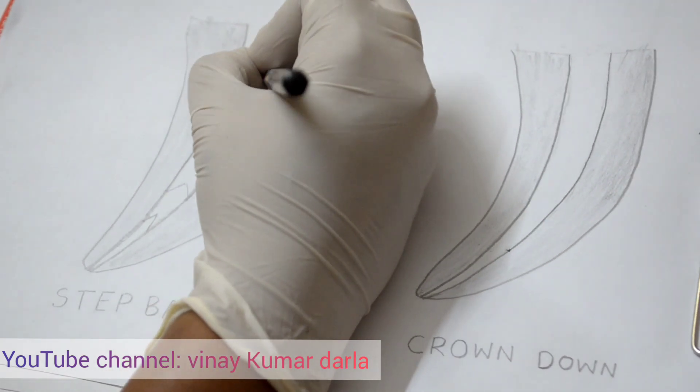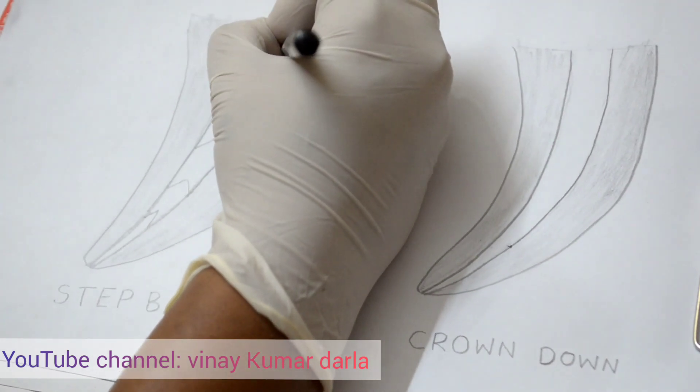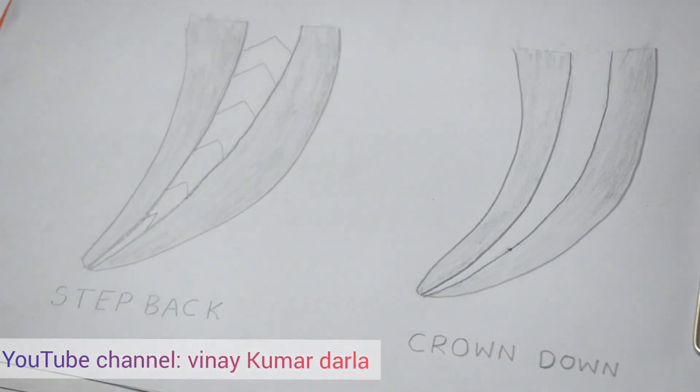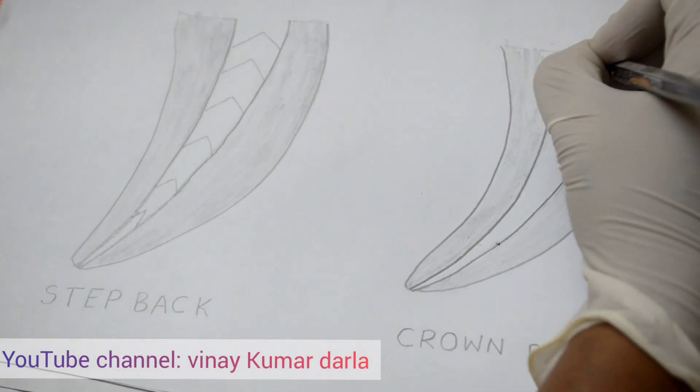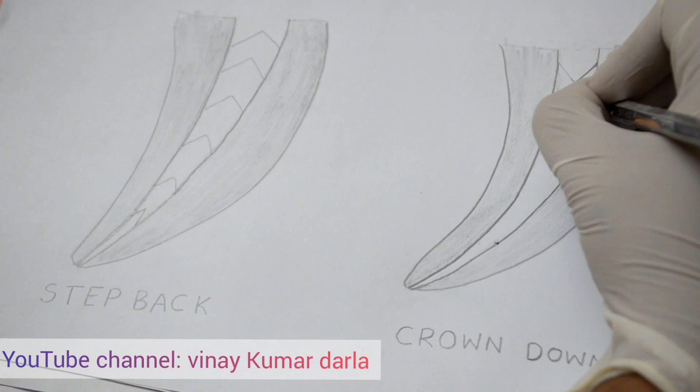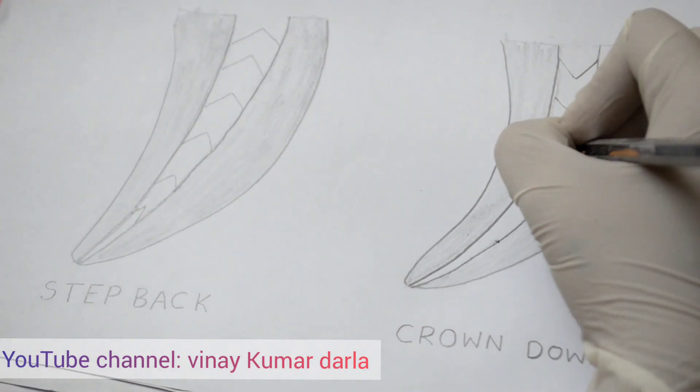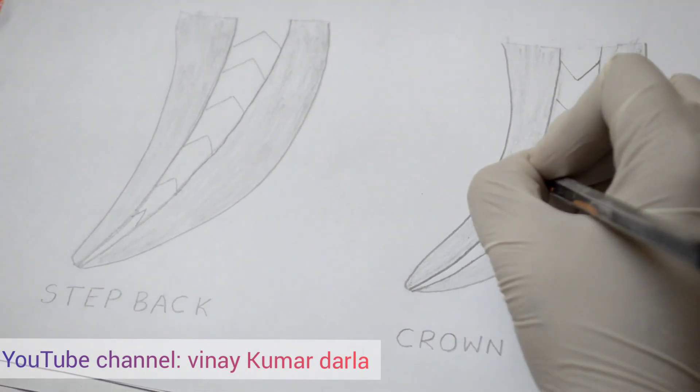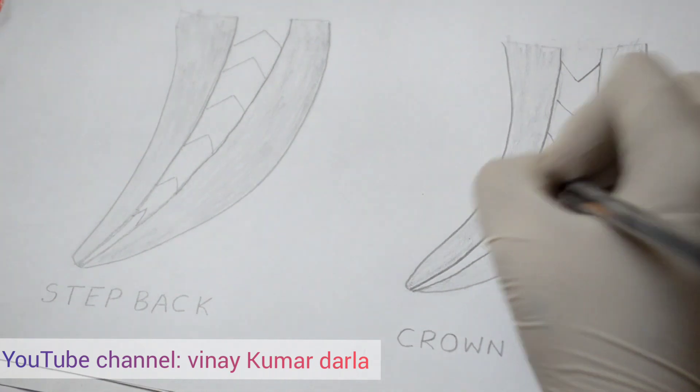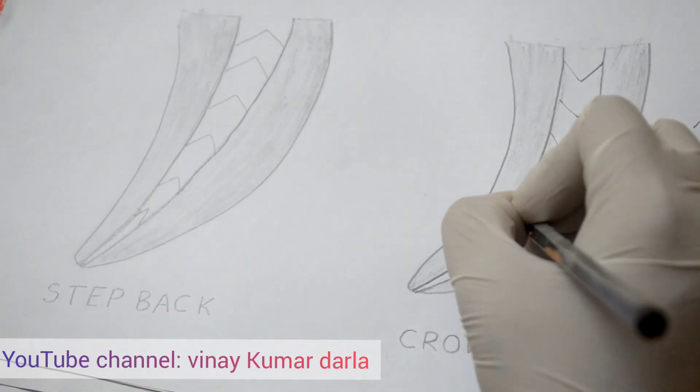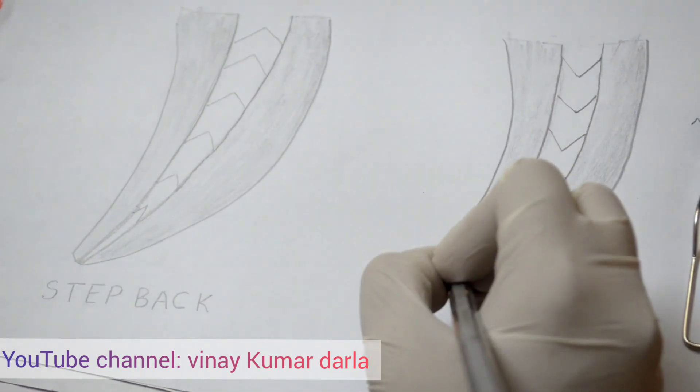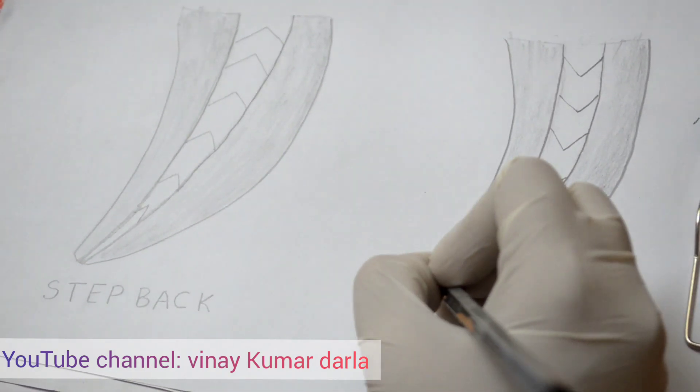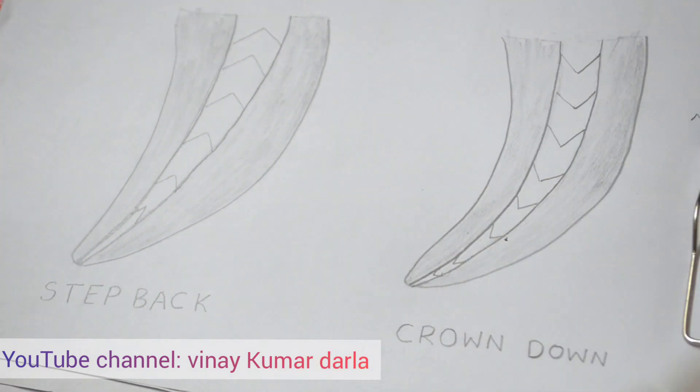Advantages of crown down technique over step back technique: The debris extrusion is minimized, thereby post-operative discomfort is reduced. Crown down technique allows better penetration of the irrigants. Furthermore, crown down technique offers better control over the apical enlargement preventing mishaps. Working length is less likely to change with this technique.